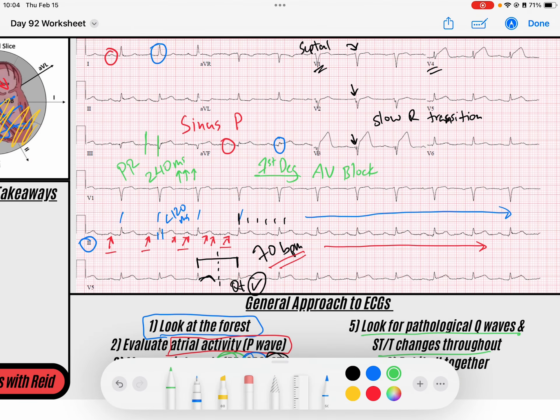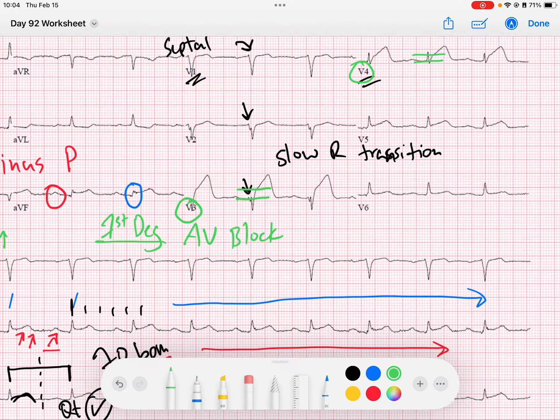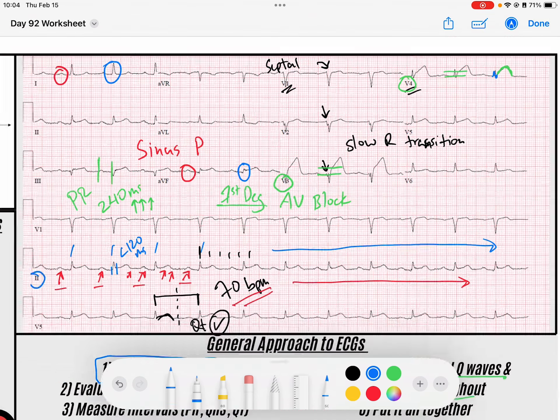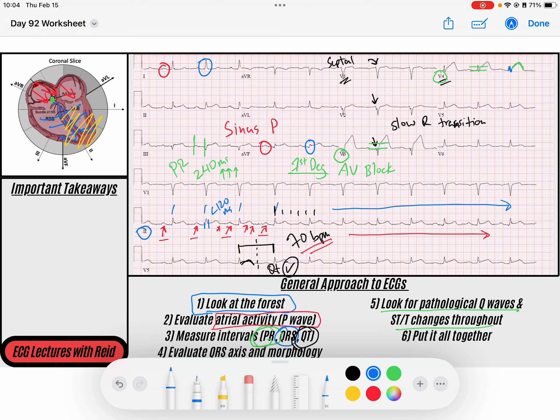The first thing I notice — and you probably noticed as well — is ST elevation most notable in the precordial leads V3 and V4. Looking at the amplitude of these hyperacute T waves compared to the amplitude of the QRS, T waves are typically about 25% of the QRS amplitude, but in this case they are very hyperacute — the area under the curve is much higher. So there is definite ST elevation with hyperacute T waves in leads V3 and V4.